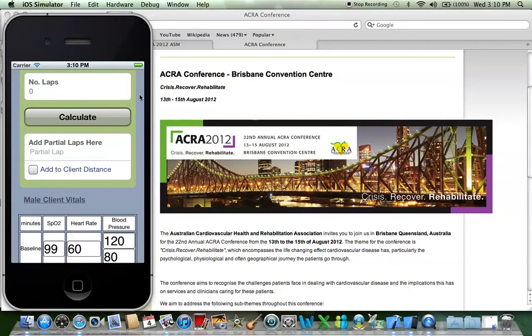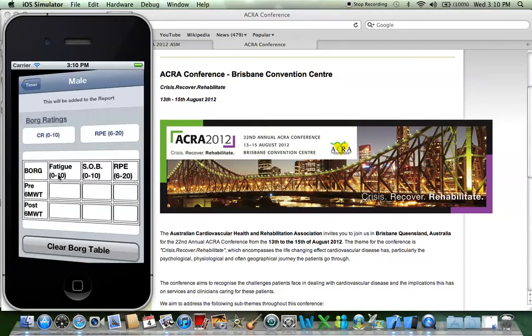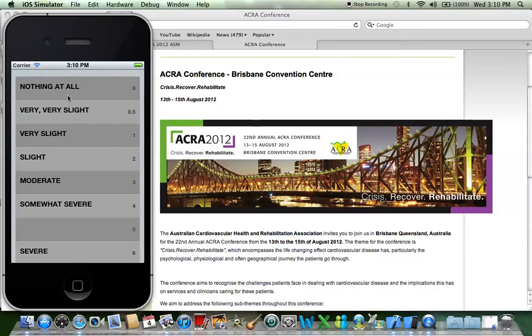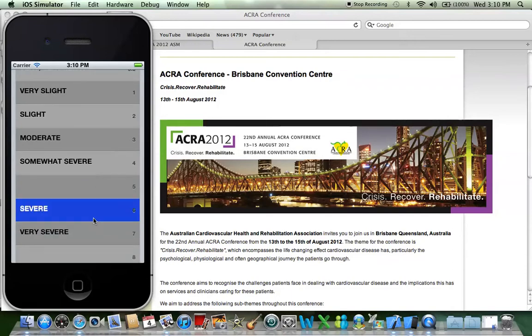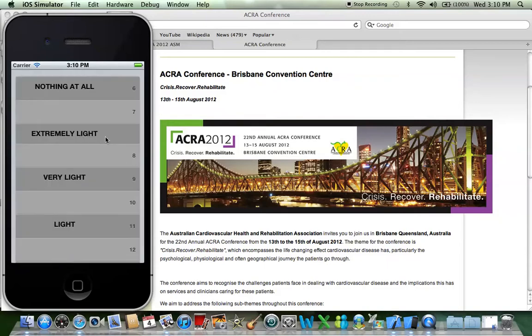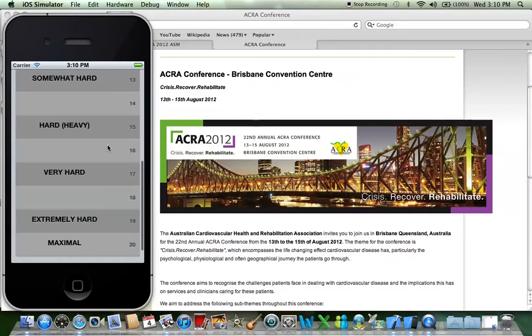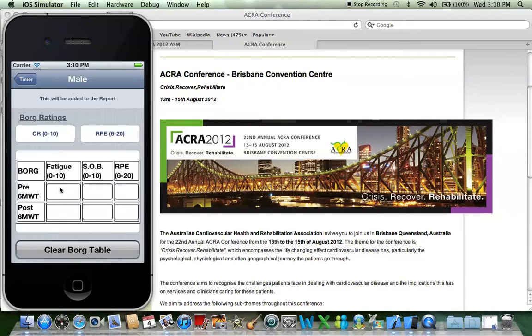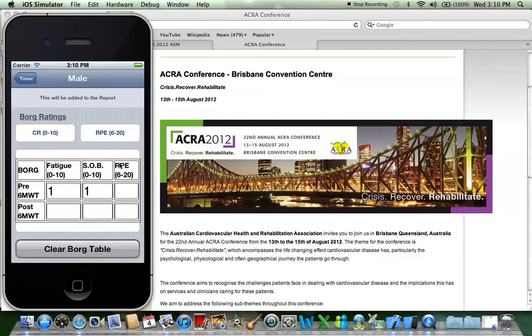What you also have as a baseline is the Borg scales. I actually have Borg scales here — this is the 0 to 10 scale for fatigue or shortness of breath, and also the rate of perceived exertion scale. For example, I'm just going to do the pre as a 1 and a 1.